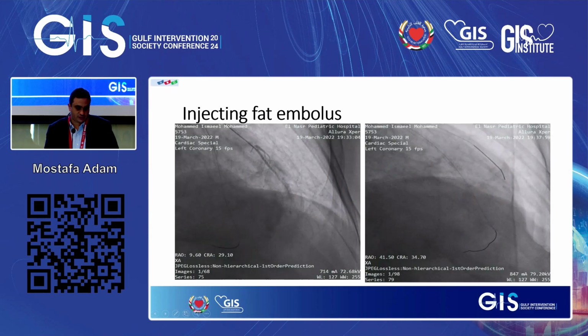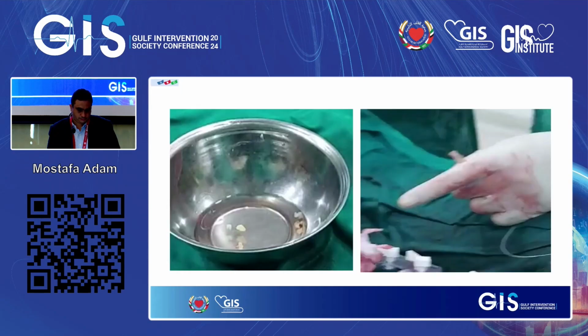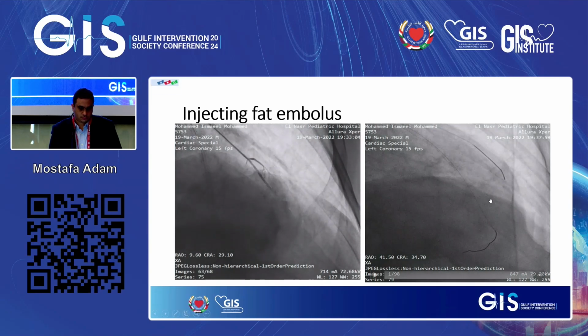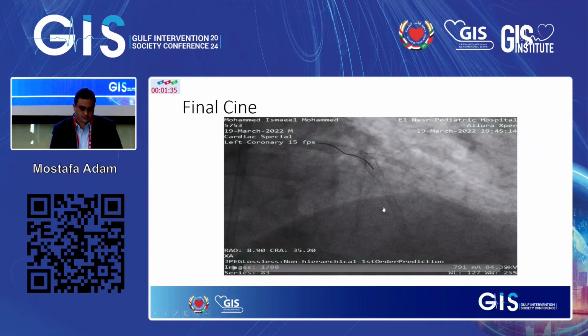This is the fat, and injecting it through the microcatheter. This is the injection. And this is the final result.